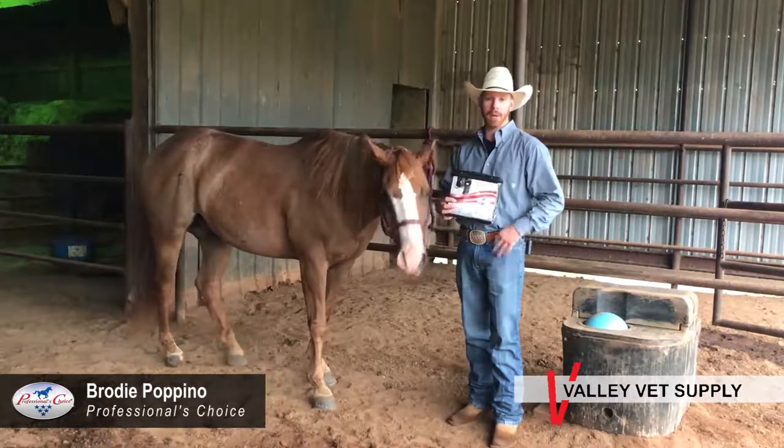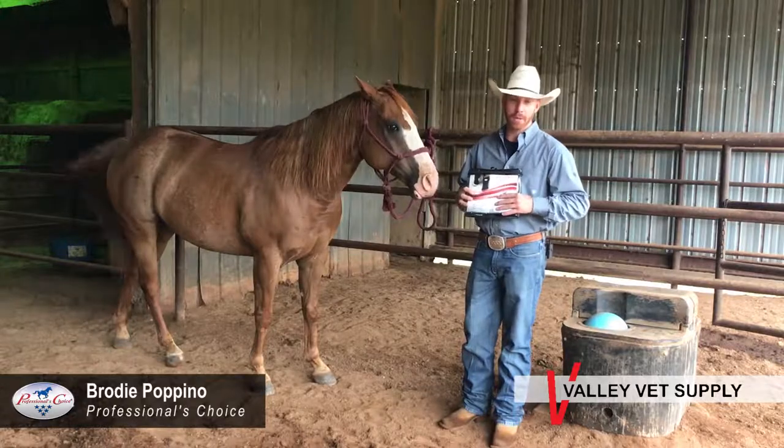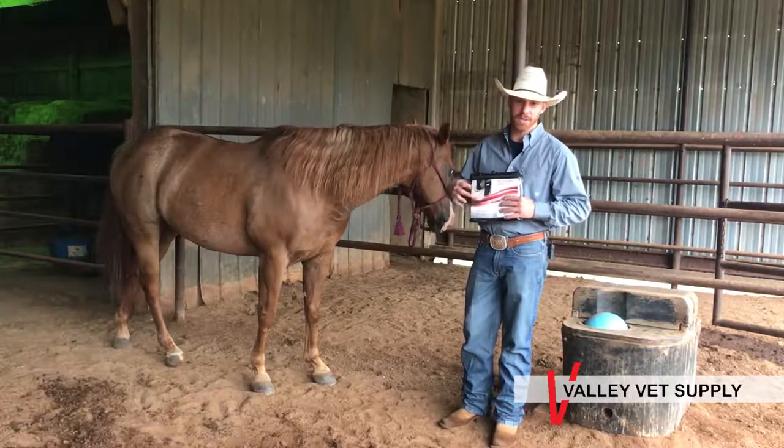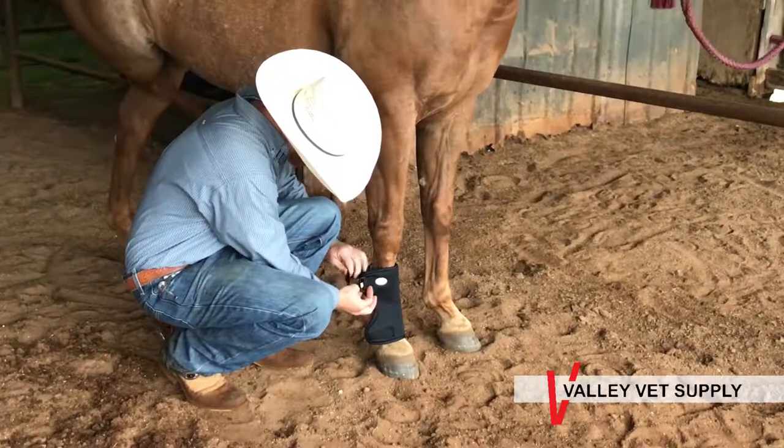Hey, Brody Papano, and today we're going to talk about bedsore boots. These are made of neoprene, so they're breathable. They've got a fleece lining, so they're soft on the horse's legs. They have our patented hook and loop Velcro straps.